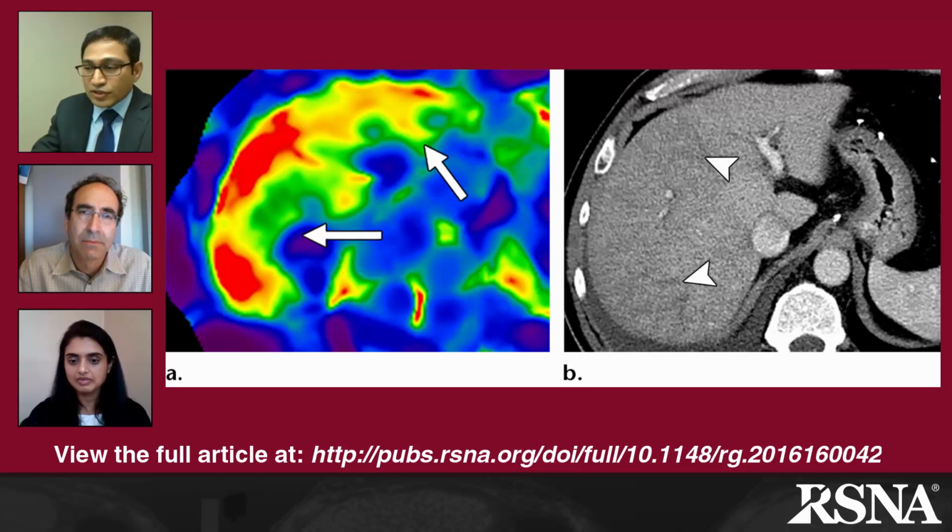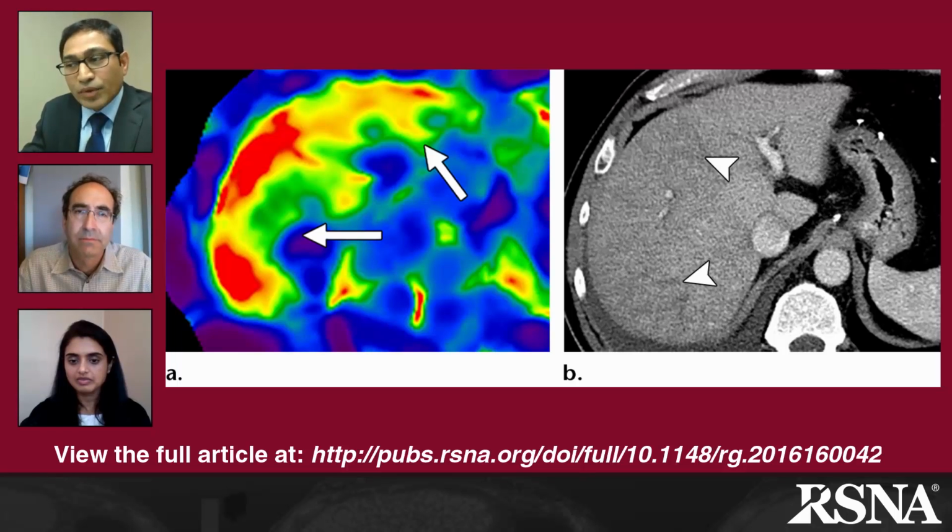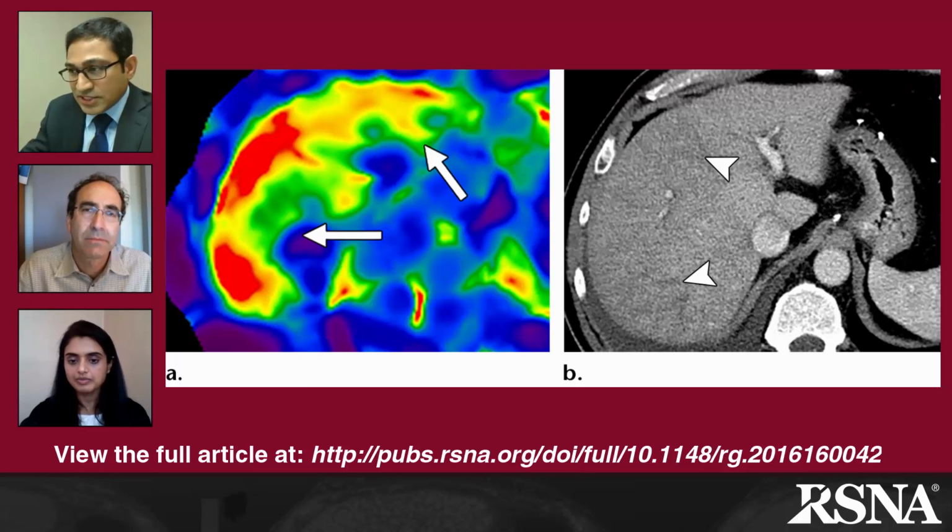The one on the left will show, I'm bringing up the image on my hand over here. The top images, A and B, on the left show the stiffness map, and on the right is the contrast enhanced CT. Now, if you look at the contrast enhanced CT, there is peripheral hypodensity where the arrowhead shows, and this is an area of passive congestion. This patient has constrictive pericarditis, and you can see the IVC is kind of congested, and this leads to passive congestion. And this passive congestion goes all the way to the sinusoid levels and stretches the capsule and predominantly affects the peripheral part of the liver.